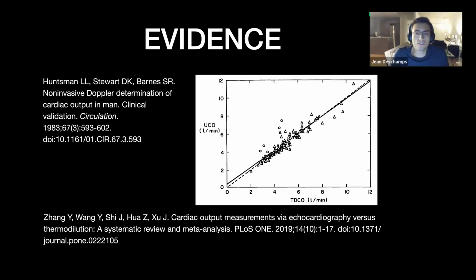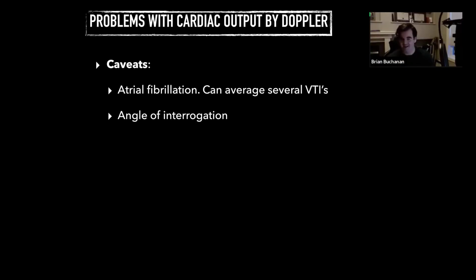I've done this kind of calibration and comparison between the two a number of times, and sometimes it's quite stunning how close they are. You almost can't believe it. You think you've tweaked the numbers somehow, but no, sometimes it's that precise. As you mentioned too, there are obviously caveats.